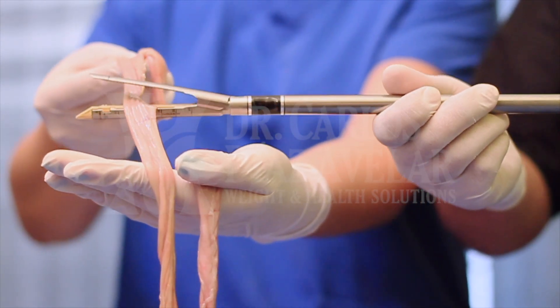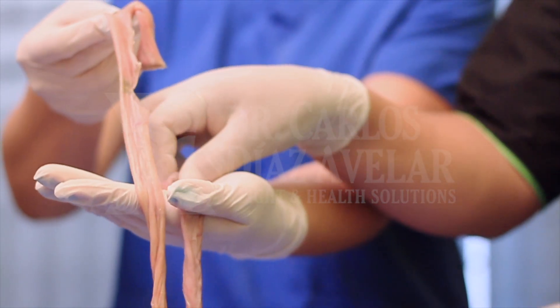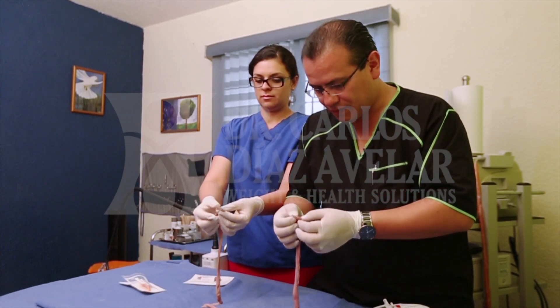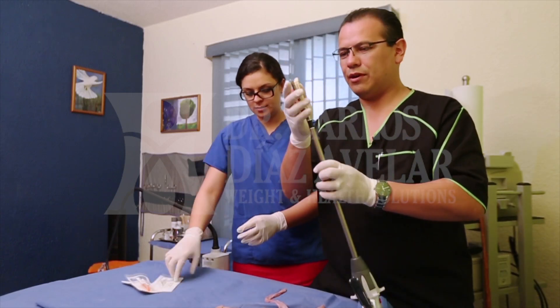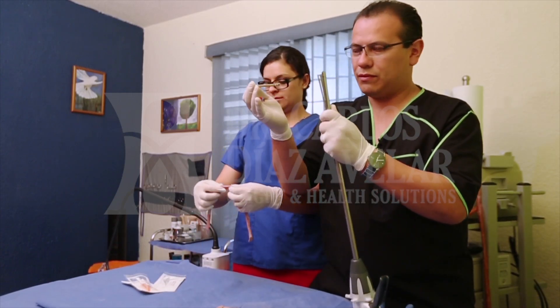As we can see, Dr. Villas opens the stapler and the intestines are separated. Those are titanium clips and the patient's intestine will be perfectly safe and sealed. Dr. Villas is going to do it one more time. That stapler is going to the trash.